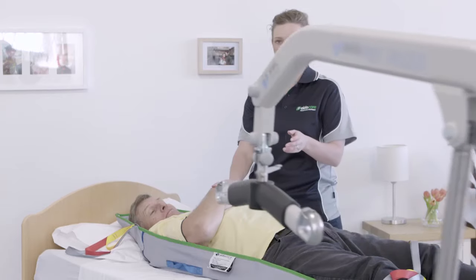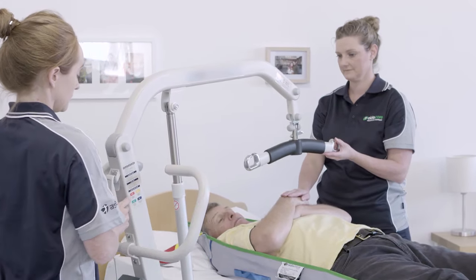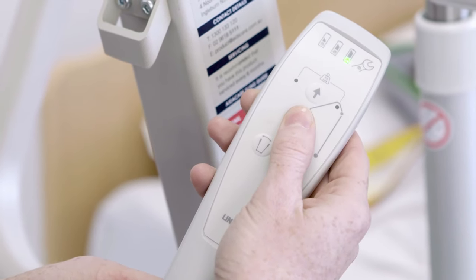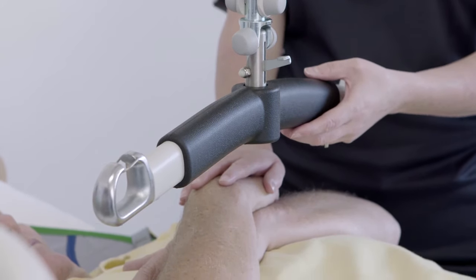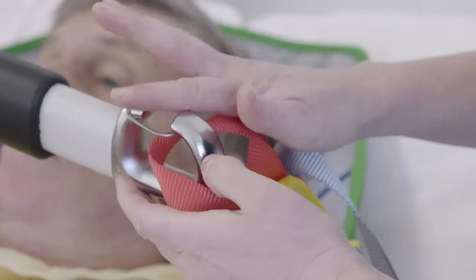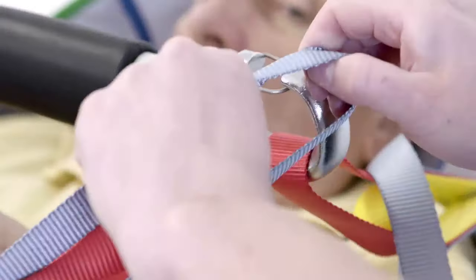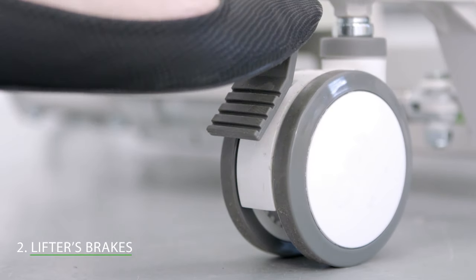When carrying out the transfer, one carer should look after the resident and the other should operate the lifter. To make attaching the sling to the lifter easier, you may wish to raise the head of the bed. Lower the spreader bar to chest level, taking extra care to ensure it doesn't come into contact with the resident. Then attach the sling to the lifter, ensuring the loops sit securely on the spreader bar. The loops you choose will differ from resident to resident depending on the transfer being carried out. Because we are doing a transfer from a bed, the lifter's brakes should be off to accommodate the sudden shift in the lifter's centre of gravity.